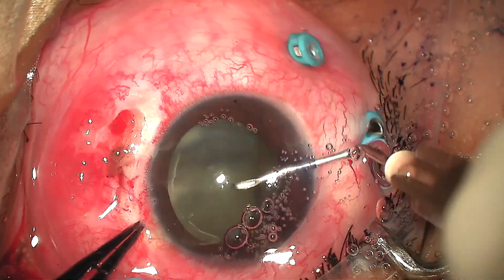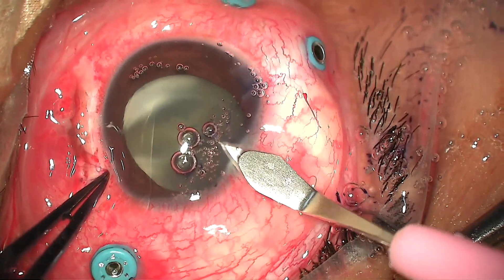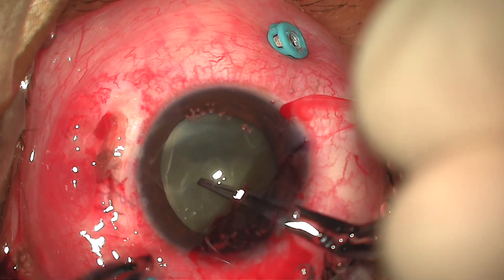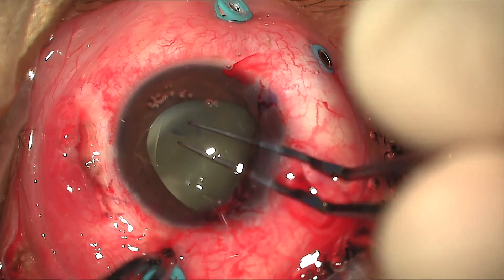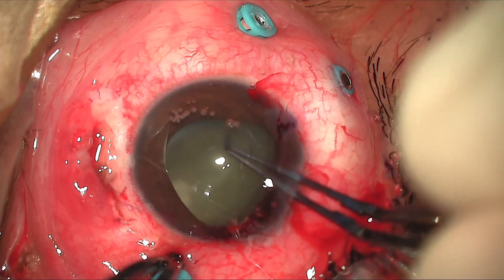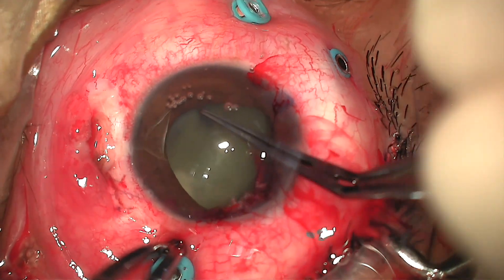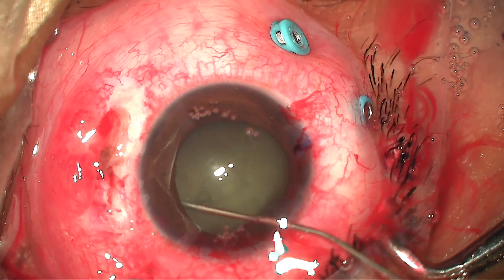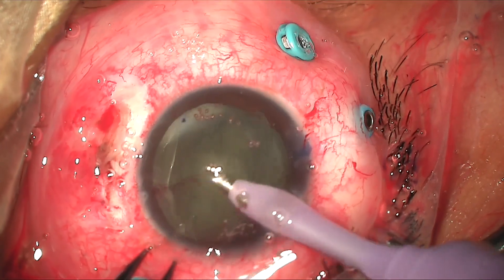Anterior capsular flap was made with a cystitome, and the capsulorhexis was completed with capsulorhexis forceps. With hydrodissection, nucleus prolapse was done and phacoemulsification was completed.